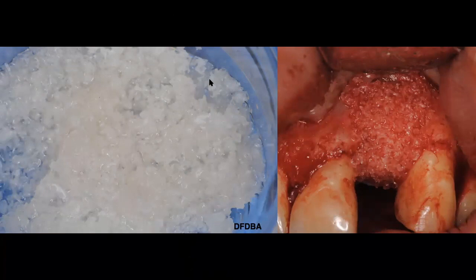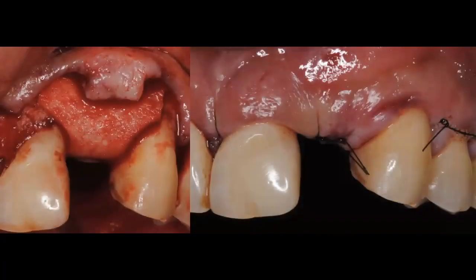Our goal is to just fill the area, get into the socket, have new bone in that area, achieve a little bit more buccolingual width of the site, and then we're going to go ahead and place a membrane. We're going to cover the graft to avoid any infiltration of tissue in the site. There's many ways that you can secure your membrane in this site. You can use titanium tacks. I like using sutures.